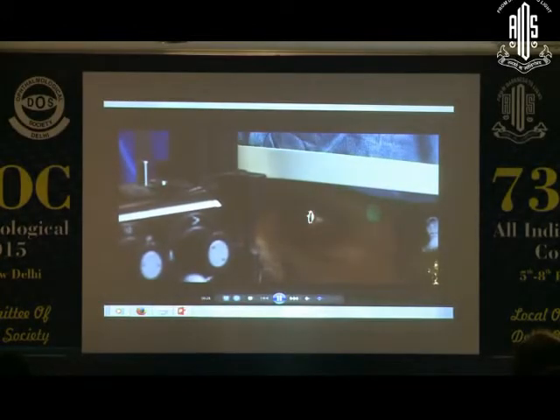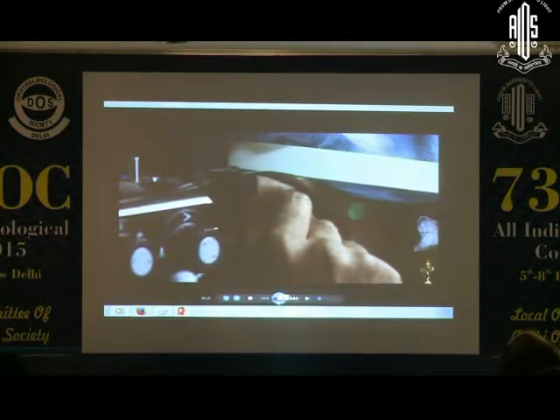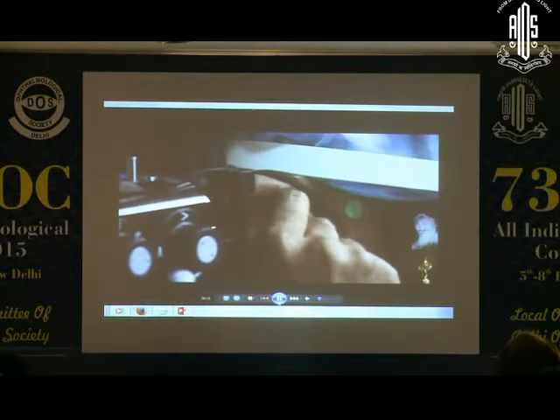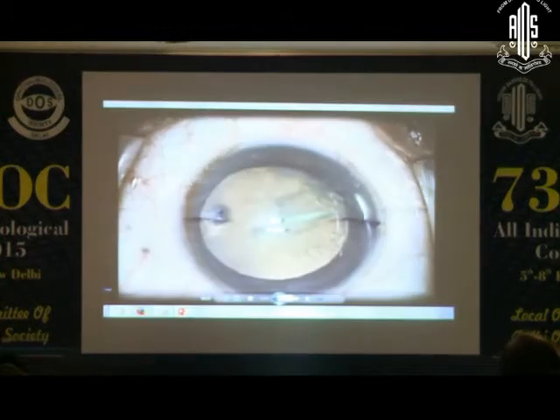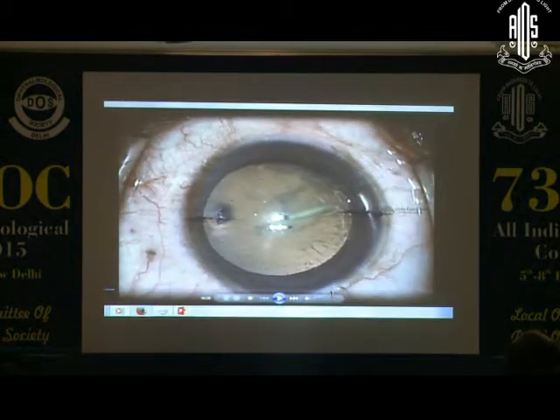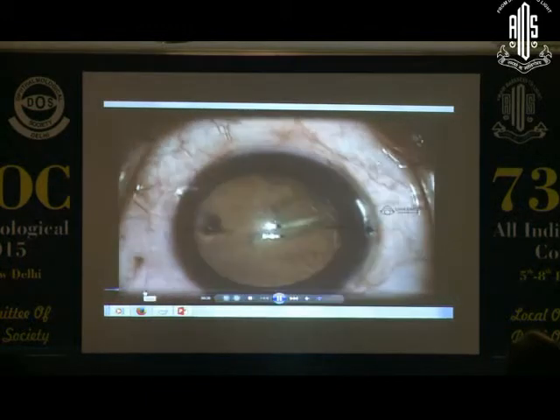Here I'm showing you the marking also. This is at 90 degrees. The patient is placed. Unfortunately, my hand is in the way, you can't see the marking, but I'm making the mark using the needle with the slit being vertical. And the marking has been highlighted already on the table. So the rest of it is similar.